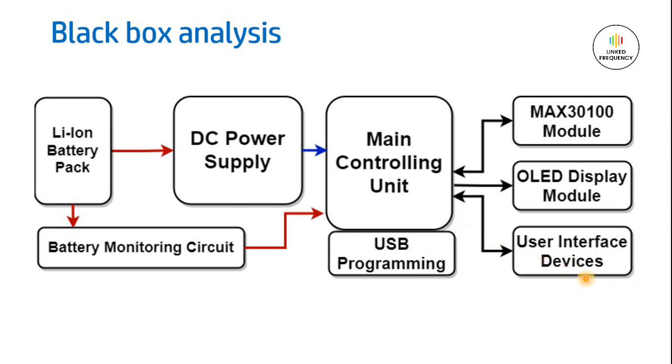What are the things to be added in the user interface device? We'll get to know in the white box analysis. This is how the black box analysis for the project looks. It is very simple, very easy for beginners to start with. However, it is not a single PCB that we are developing. It is an integration of multiple modules available in the market.